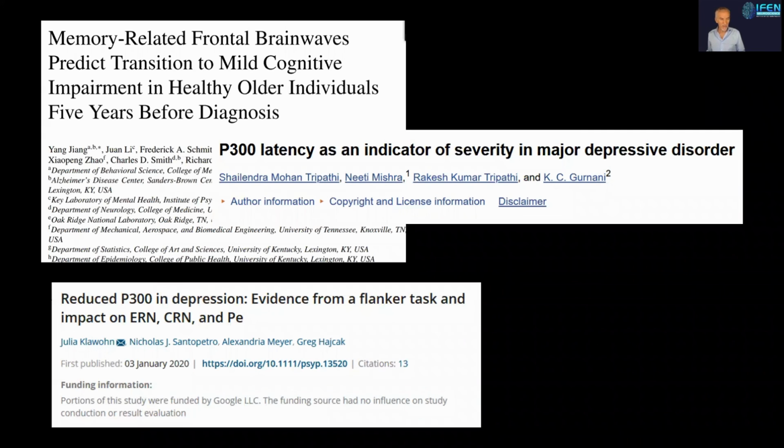And here are some examples of research and findings which we think are very important. We think that it is about time that the enormous potential of this method will be more and more established in clinical practice, with easy-to-use methods for both the researcher and the clinician.